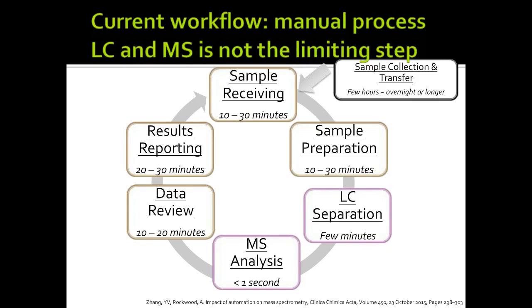Then we go through the sample receiving side, say 10 or 30 minutes, and then go through sample preparation. It's another focus on the time we're talking about, 10 or 30 minutes, and this is also a manual process. After the sample is processed, we can go down to the mass spec.